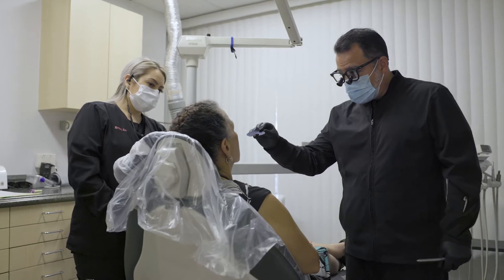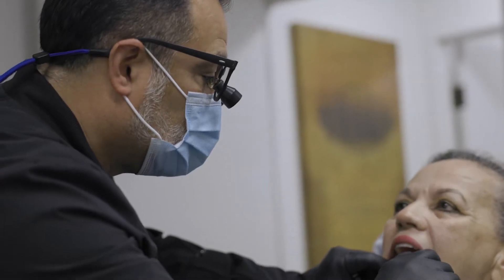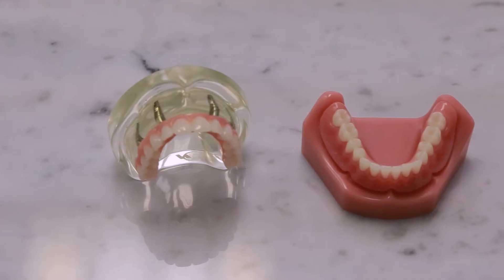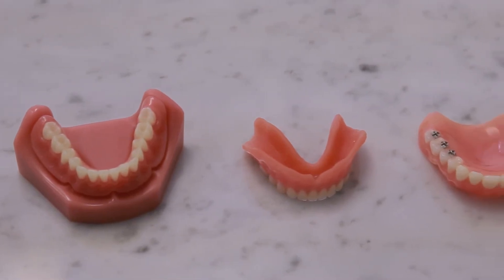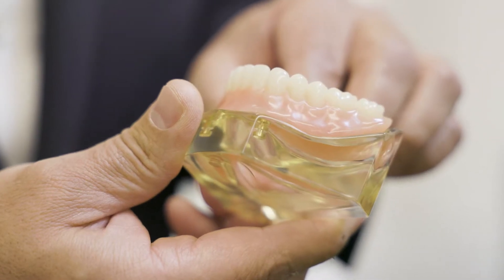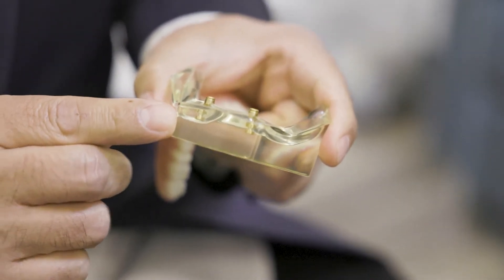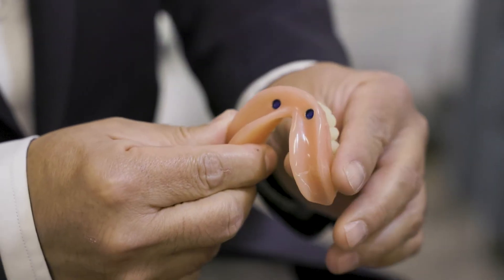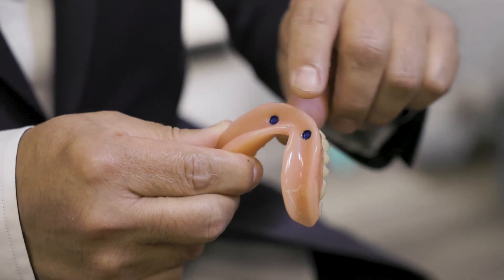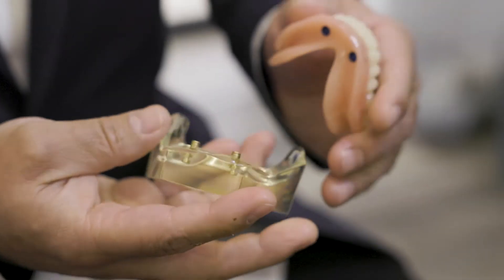For patients that are edentulous — meaning without teeth — or have teeth that soon they'll be without, we have several general options. The first option that incorporates implants on the bottom involves a minimum of two implants. They get placed in the canine area, and then we have a denture that has precision attachments that will literally snap on to those two implants.